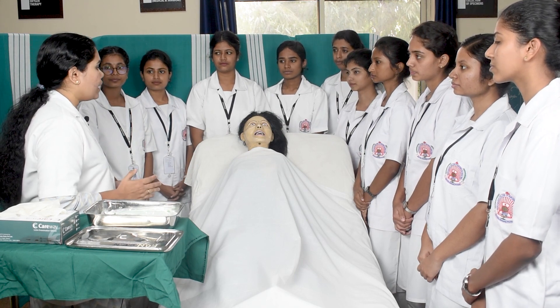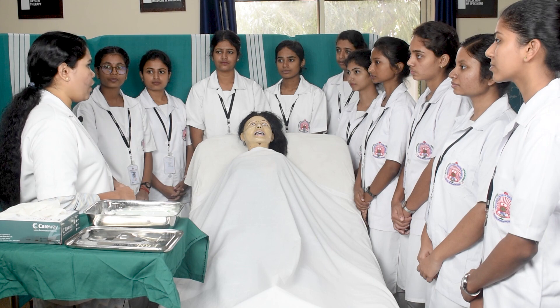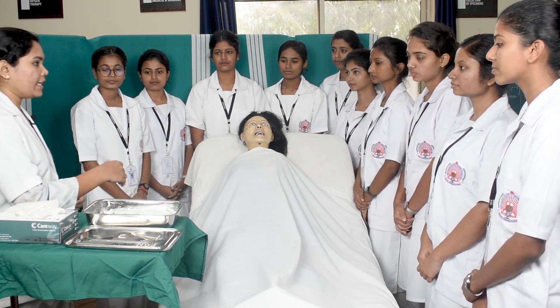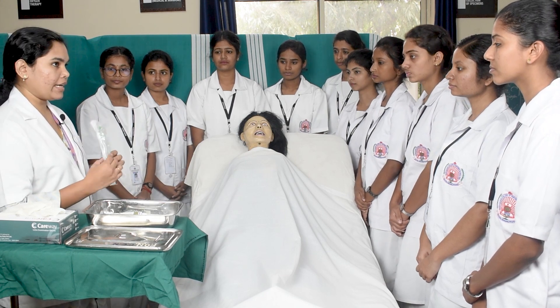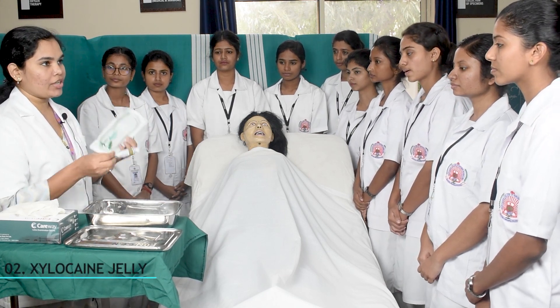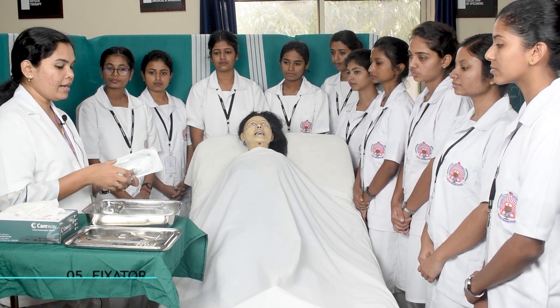The position we will be assuming for introducing a ryle's tube is Fowler's position. The articles needed for inserting a ryle's tube are: one ryle's tube, one xylocaine jelly, one 50cc syringe, some gauze pads, and one fixator.